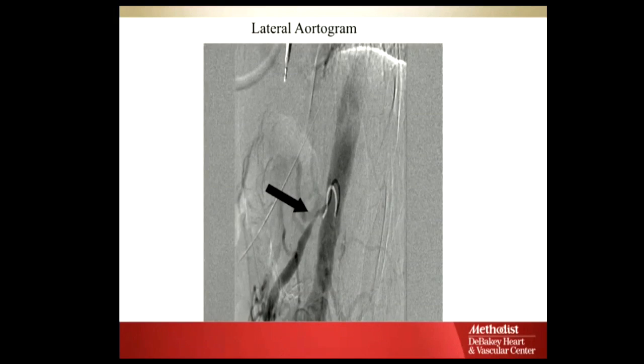And so you got to push it up in an area where there's enough room, or you engage the tip in an orifice, and then you push up, and you pull the wire back, because this one is engaged, pulling the catheter down. Okay, and so the idea is it comes down like that and pops right into it. So these are useful catheters, but they can also be a bit of a pain to reform. And so this is downward projecting. There are shepherd's crook catheters, Sims catheters, a variety of different things you can get, and that's usually how you show an SMA.